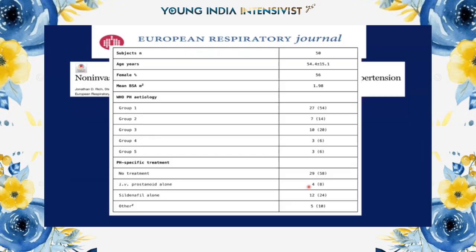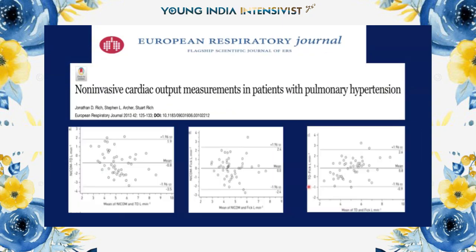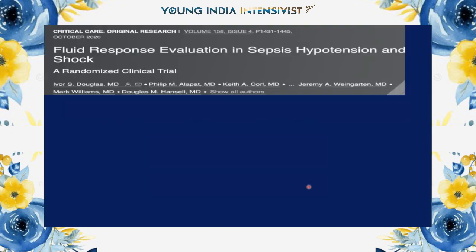In this study, they compared patients with pulmonary hypertension using three different devices: thermodilution, bioreactance, along with the Fick principle. And here they used non-invasive bioreactance-based passive leg raising to assess fluid responsiveness.